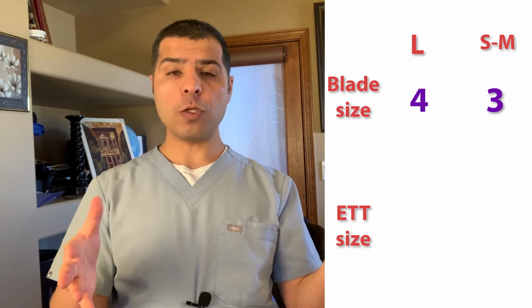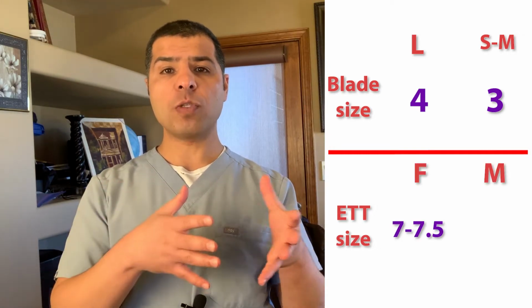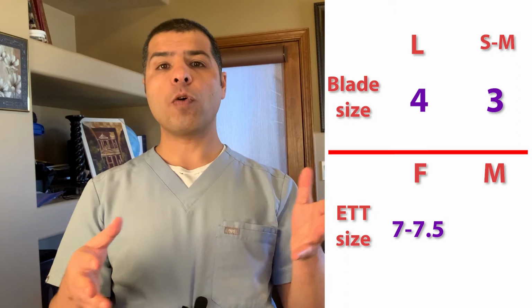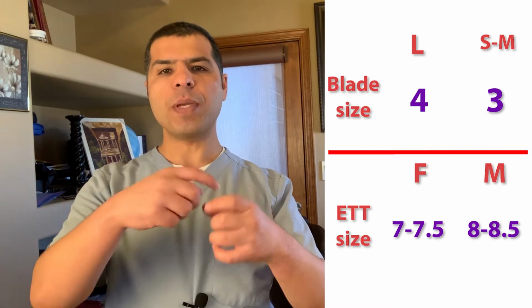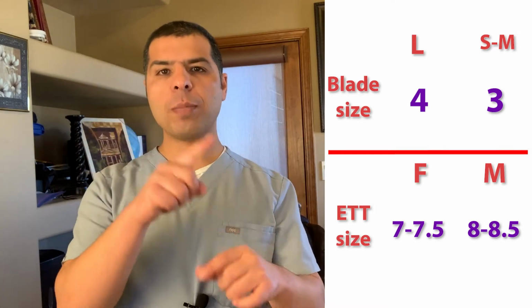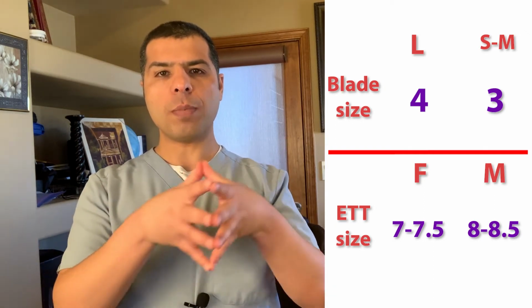And remember, the ET tube size, usually here I use the gender. For females, 7 to 7.5 millimeter, and for males, 8 to 8.5 millimeter. So I told them, hey, give me ET tube size 8. So they automatically understand size 8 means 8 millimeter, the inner diameter of the ET tube. So you need to tell your respiratory therapist about that.